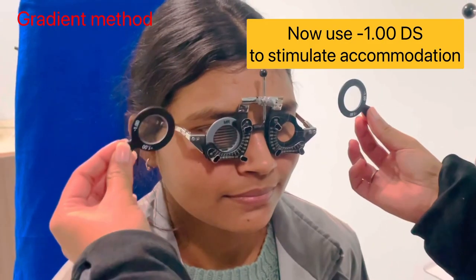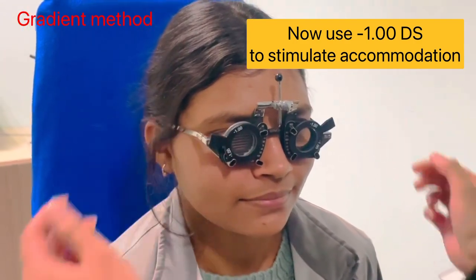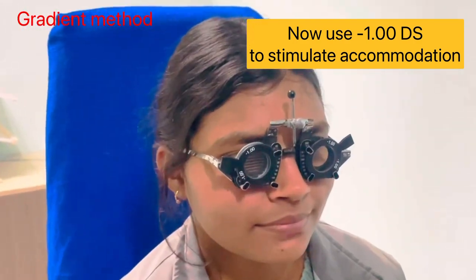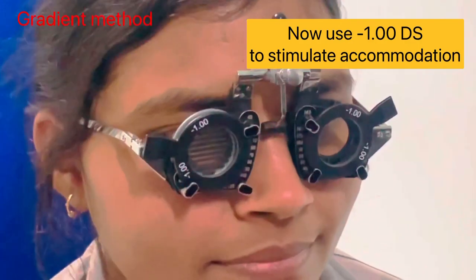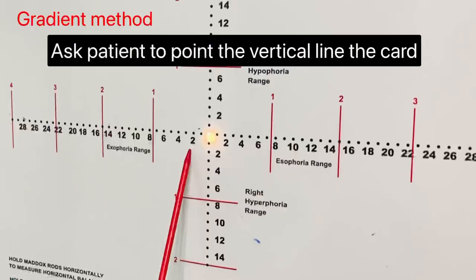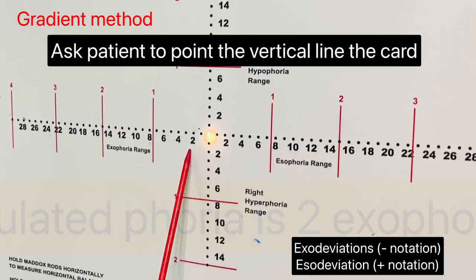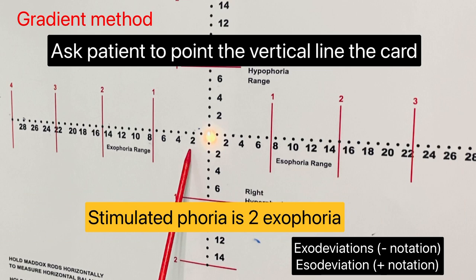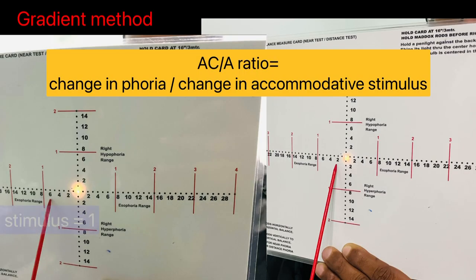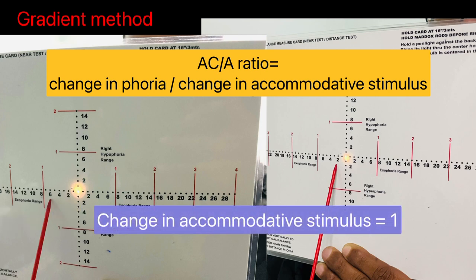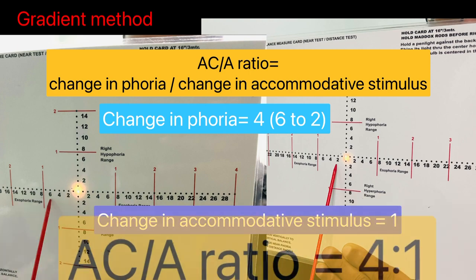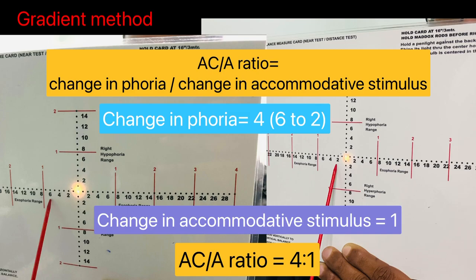Now you need to stimulate accommodation with minus lenses, either minus one or minus two diopters, to check the accommodative convergence. Here we use minus one diopter and the stimulated phoria came out to be minus two exo. The change in the phoria from without any lenses to minus one diopter came out to be four. Since the minus one diopter was used, therefore the AC/A ratio was 4:1.